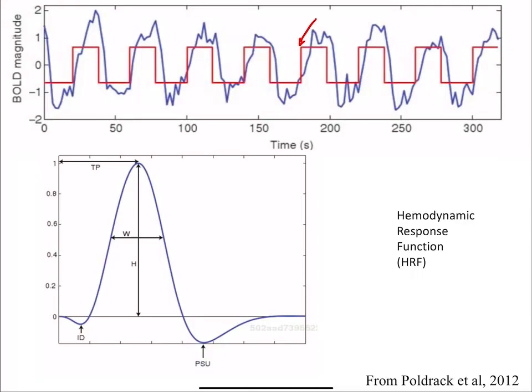And then what we get in the different voxels, if it's a voxel where there's activation, then hopefully you should see some activation. Okay? And if you don't, then you're like, oh, this new method doesn't really work, or something's wrong. So that's sort of a good test.